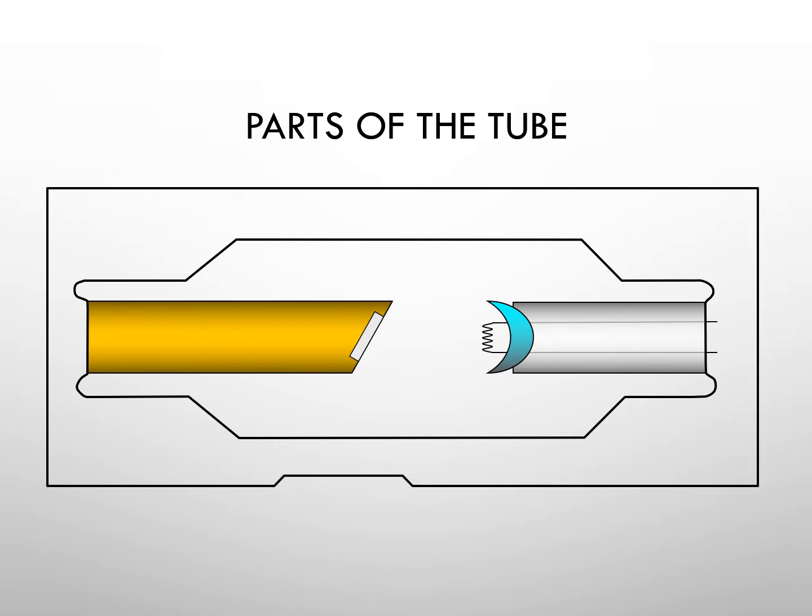An aluminum shell lined with lead surrounds the tube, and this is called the tube housing. X-rays cannot be redirected once produced, so a lead covering is required to stop the non-useful off-axis radiation, called stem radiation. A 1 or 2 inch hole is cut in the housing and blocked with plastic. This is where the X-rays are allowed to escape the housing. This is the tube port. The collimator is bolted onto the port to further shape the beam to meet our needs.